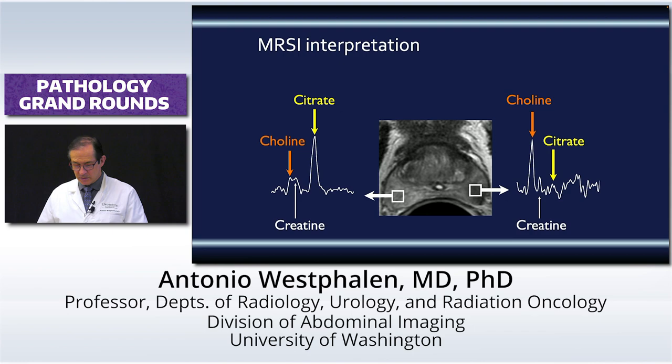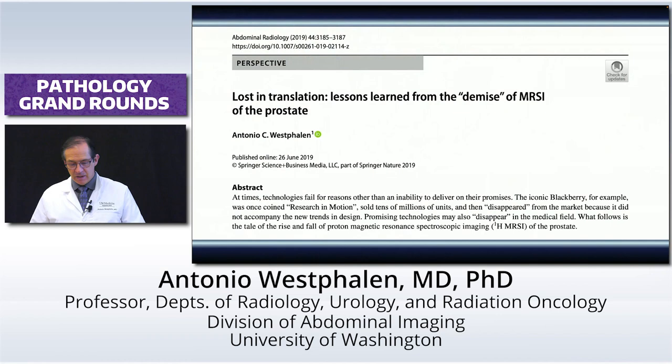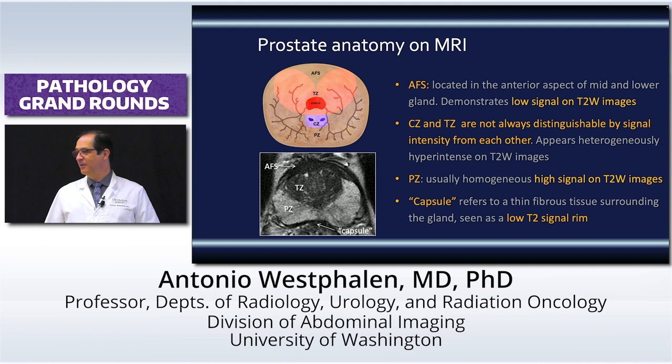And this works. It works, but it's dead. No one is really using it anymore. And I wrote a little thing about this. So UCSF was probably one of the main sites using MR spectroscopic imaging for the prostate, and we had to give up on it. And it basically, for the same reason we didn't use pharmacokinetic models, because of the complexity of the technique.